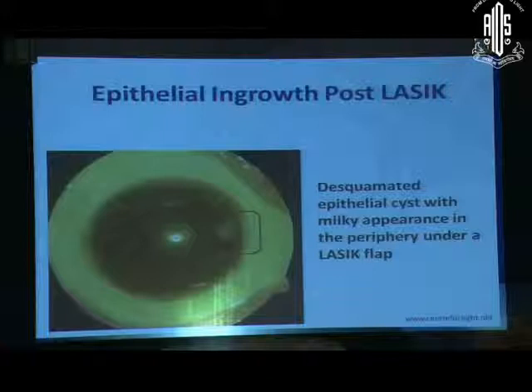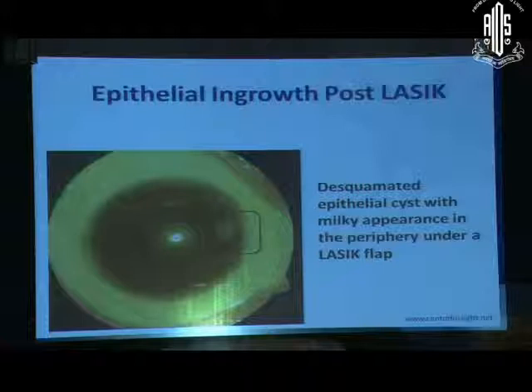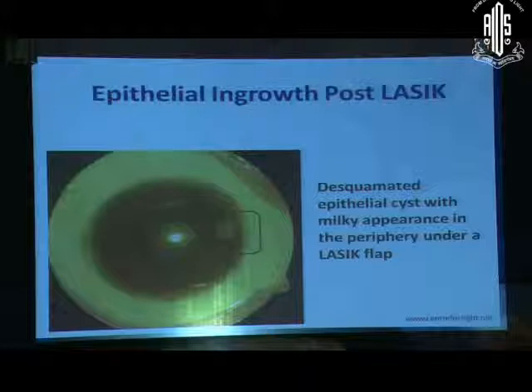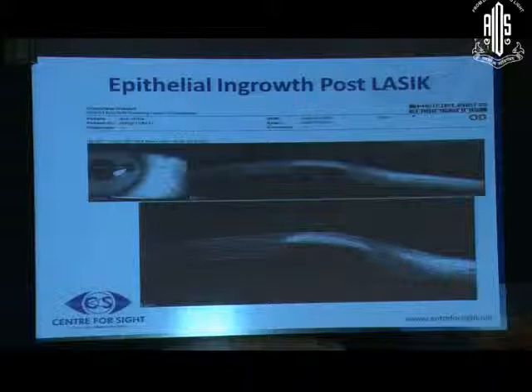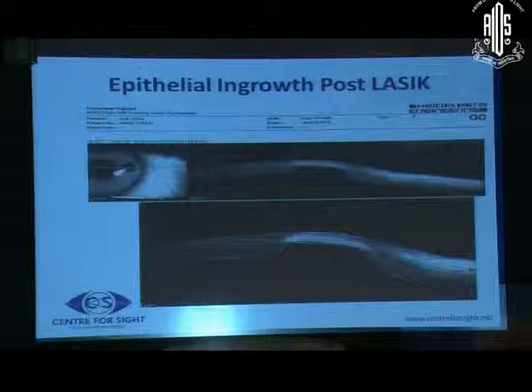This was a case where the patient had a white patchy area of milky appearance at the periphery of the flap edge — a case of epithelial ingrowth. Anterior segment OCT showed the epithelial ingrowth to be much broader in size, and there was thinning of the overlying flap. So this patient needed surgical intervention.